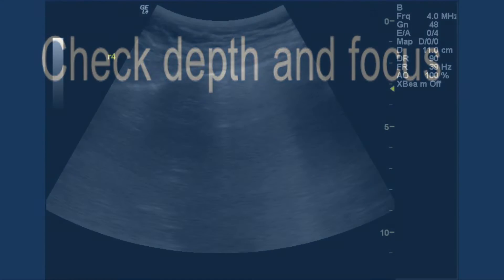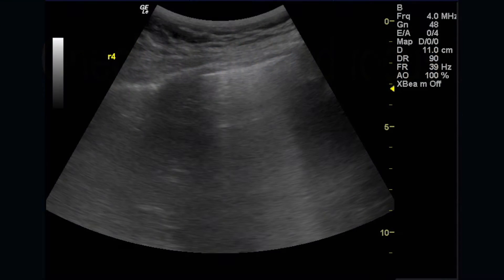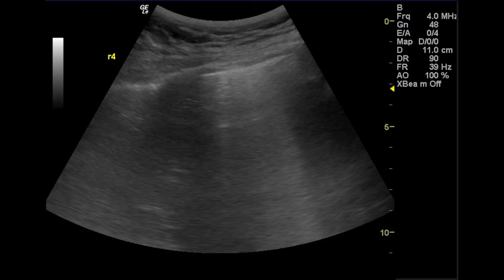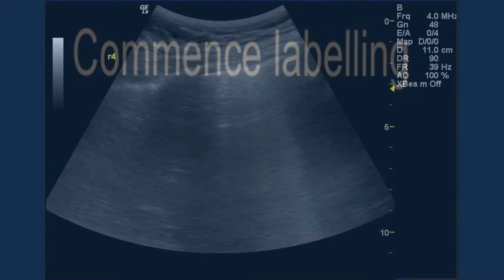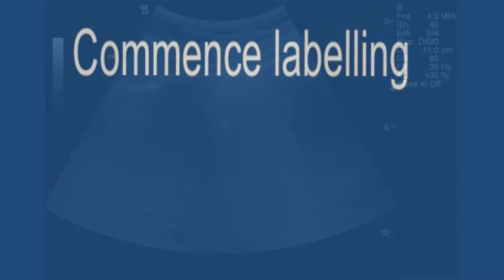Lung ultrasound is predominantly the study of artefact, so you must lower the depth and raise the focus contrary to usual practice. You're aiming for a picture like this, with at least one rib shadow and a white line sliding just beneath.